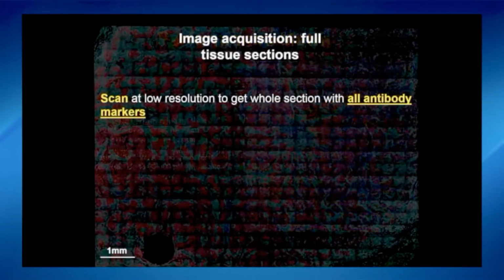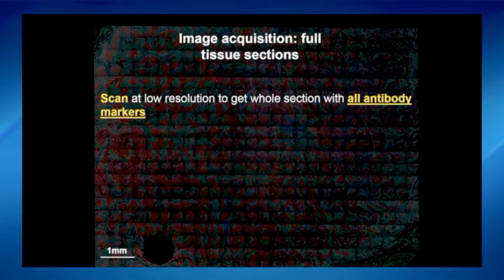So then, what's the use of having the big resolution range? Well, I'm going to show you two quick use cases that we have in the lab. One is where we're looking at full tissue sections and identifying regions of interest. The other, which is the one we try to do for the larger cohorts, is tissue microarray analysis.